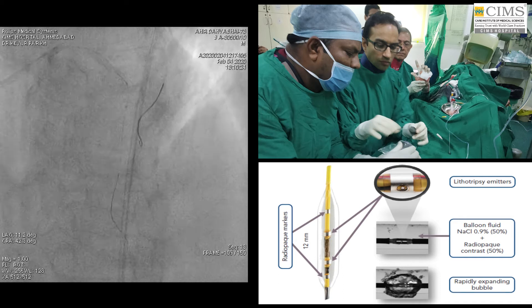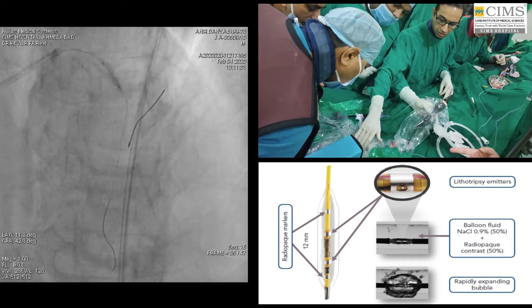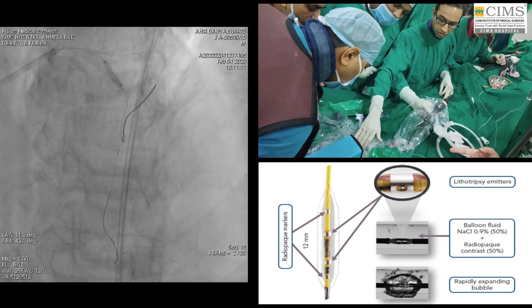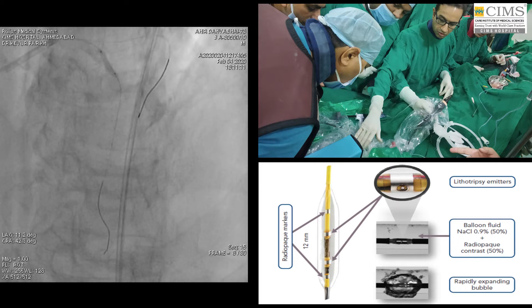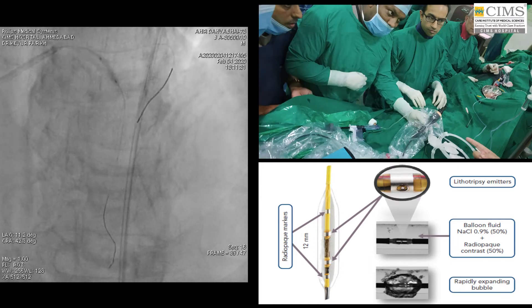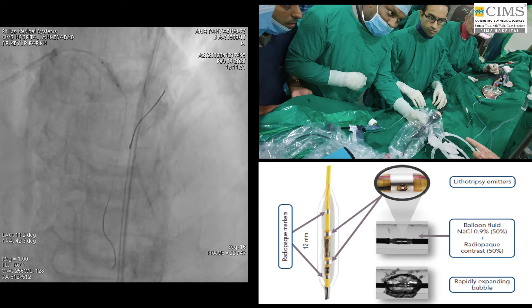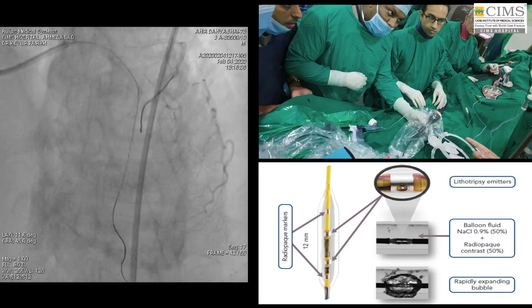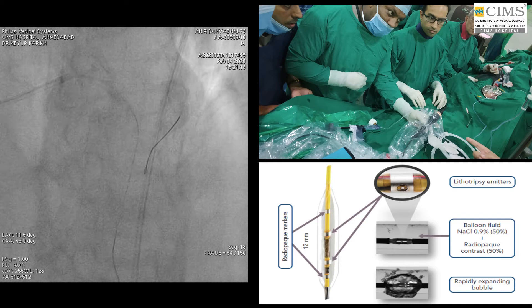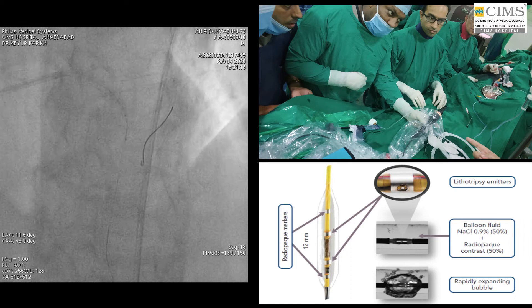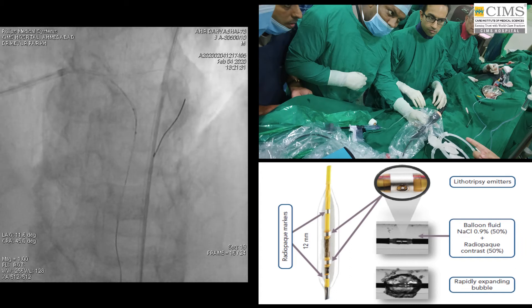Inside the balloon are lithotripsy emitters. The balloon is filled with a 50/50 mixture of saline and contrast. Once inflated you will see a rapidly expanding bubble. We now advance the balloon and start generating impulses using the generator. The balloon is inflated at 4 atmospheres and an impulse is generated. Each balloon has 10 impulses per cycle and up to 8 cycles. We will start doing lithotripsy of the artery, beginning distally then moving proximally, where multiple inflations and multiple cycles will be performed over the areas of calcium.